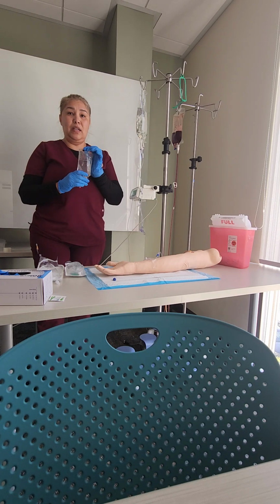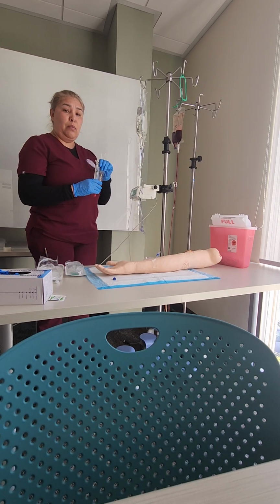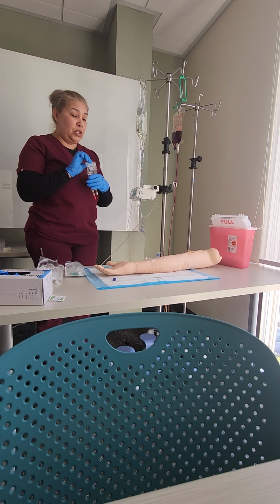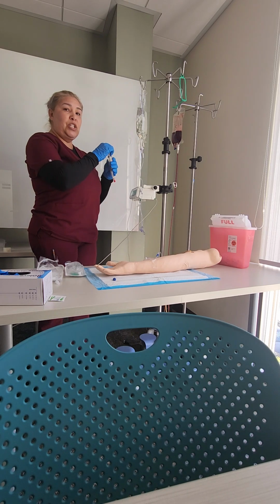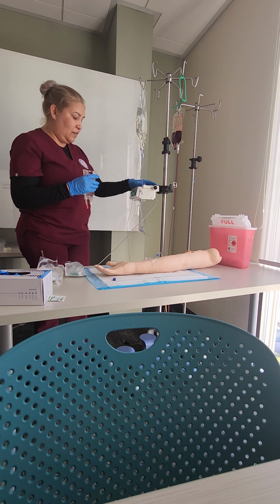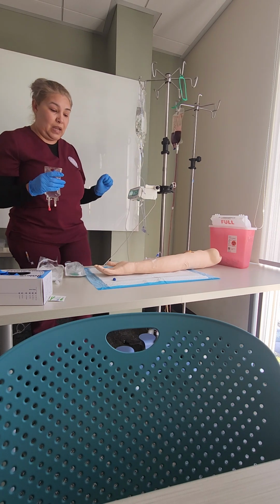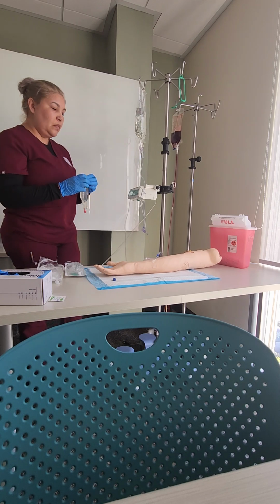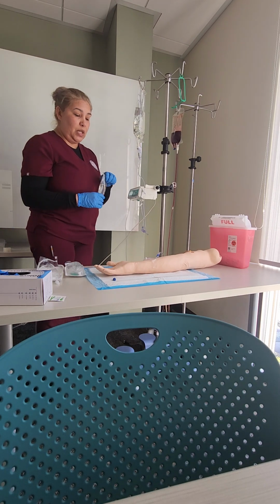Now, since I do know I have a secondary that I want to hang, I'm going to hang my antibiotics. I have already checked with the MAR. I have already done my patient's rights. I have already checked it here in the room. So now that I have everything going, I'm going to hang my second. So I'm going to explain to the patient.